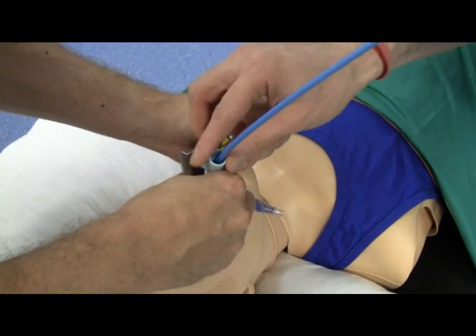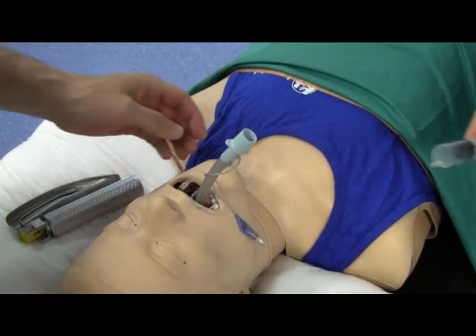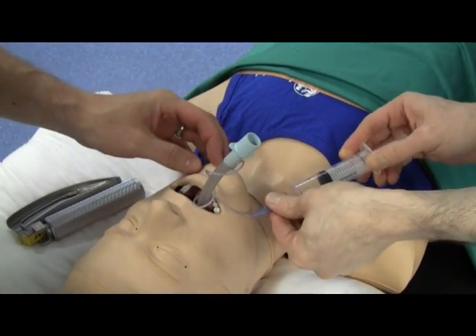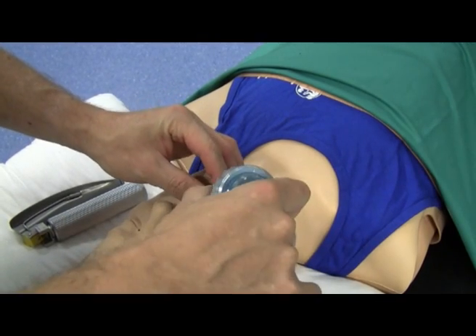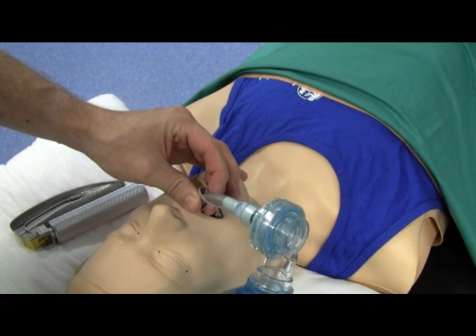Remove your bougie. Remove your laryngoscope. Inflate the cuff of the tube and attach the ambu bag. Last thing — confirm that you can ventilate the mannequin's lungs.